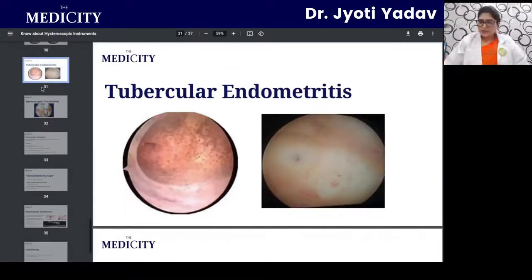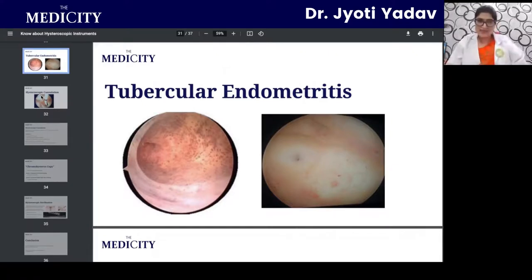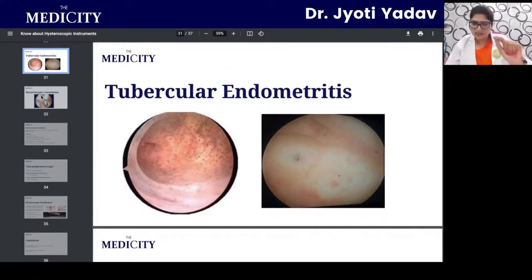Tubercular endometritis is one of the commonest infections seen hysteroscopically — the image shows petechiae, appearing as different scattered spots present throughout the cavity.